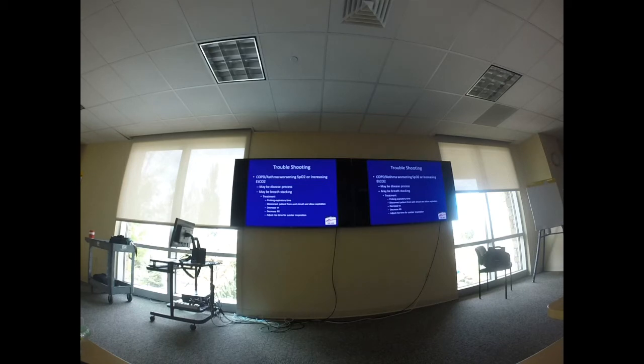If they're having a worsening pulse ox and it's a COPD or an asthma type of a condition, it could be the disease process. Or these are two conditions where I would really look for breath stacking or auto-peeping, like I showed you guys earlier. And with that, these are some things that we're going to do for it. So prolong their expiratory time. And we talked about the ways to do that. It would be to decrease the rate or decrease the I time.